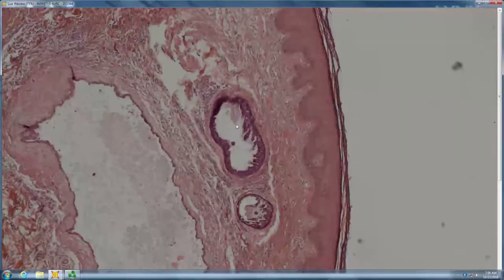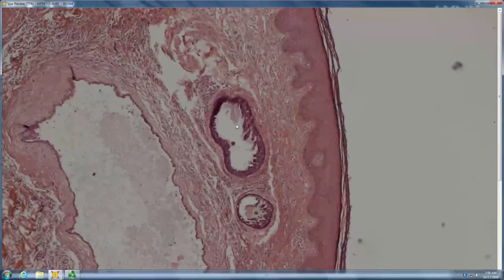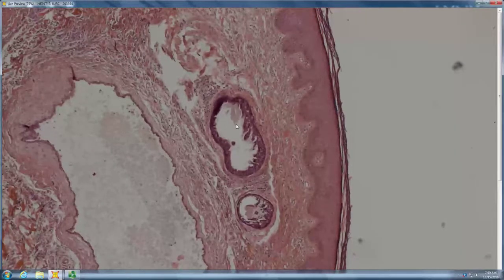What if it's on the eyelid? This does not look like eyelid skin, but what if it were on the eyelid? Should be cautious for the mucin-producing carcinoma. Well done. Someone pass that easy button over here. Okay, go ahead. Thank you.